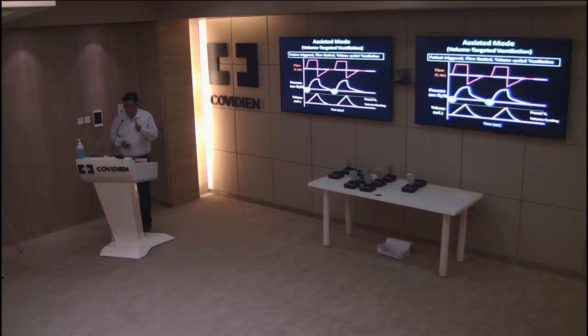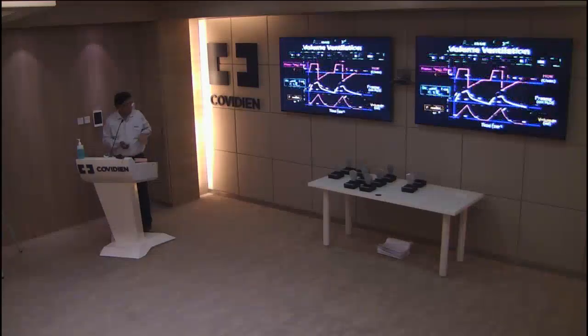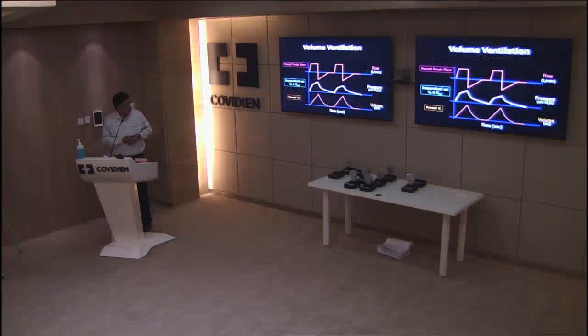Any questions? Please ask me. It's not very difficult. Like I said, in volume control ventilation, the flow will remain constant and the volume will remain constant, but what will change could be the pressure. The pressure delivered at the tidal volume might change depending on the resistance and compliance of the airways. If the resistance increases or the compliance decreases, the pressure required to deliver the tidal volume will increase. So pressure might vary, but the flow and tidal volume are constant in volume cycled ventilation.